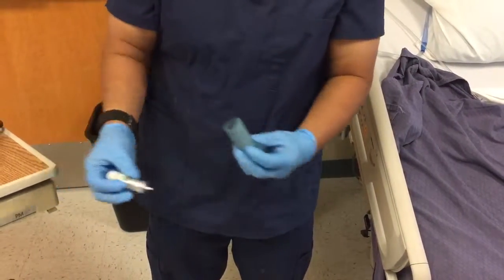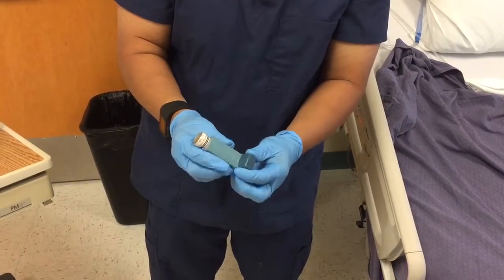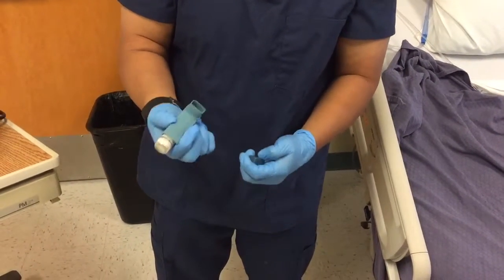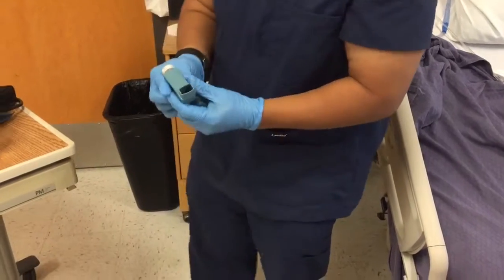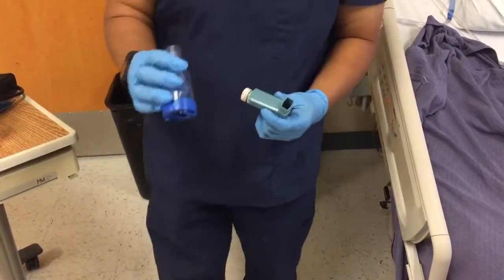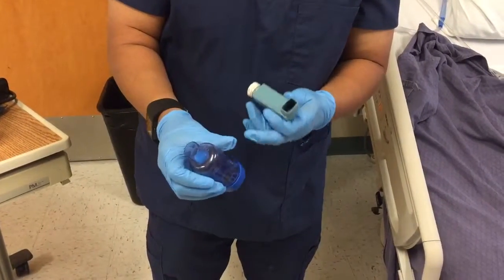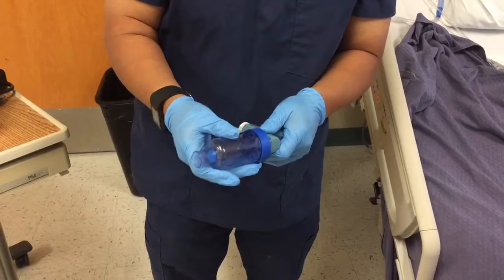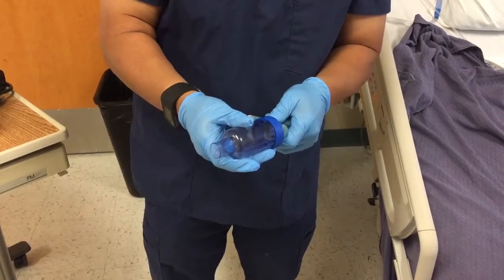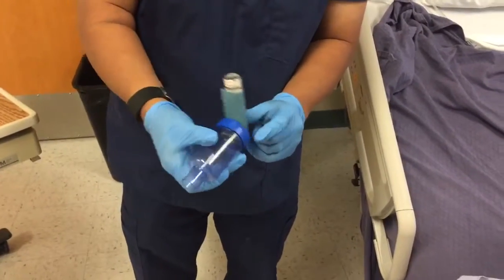You would go ahead and insert that inside the inhaler, remove the cap, and in addition, we do have a holding chamber, and the holding chamber essentially captures the aerosol ready for use. So we go ahead and put this through.